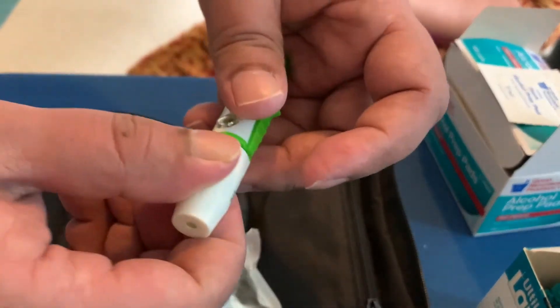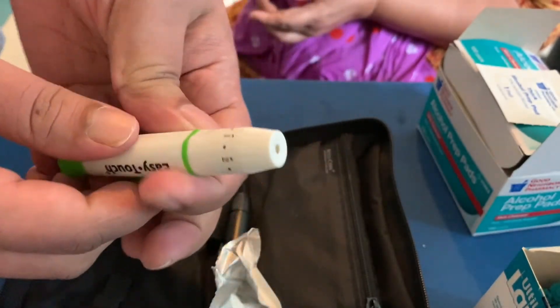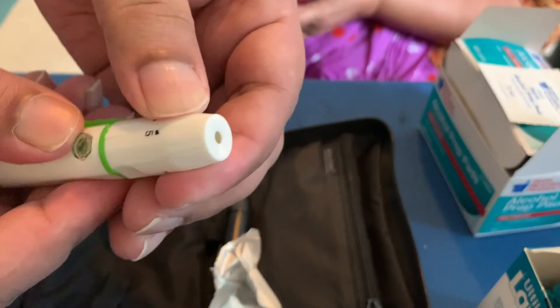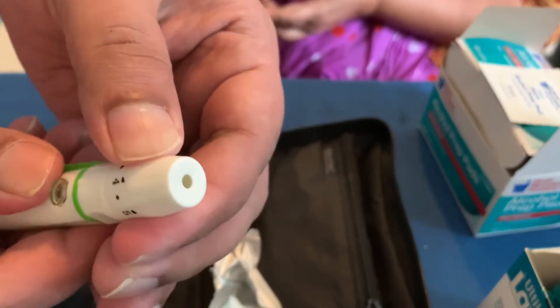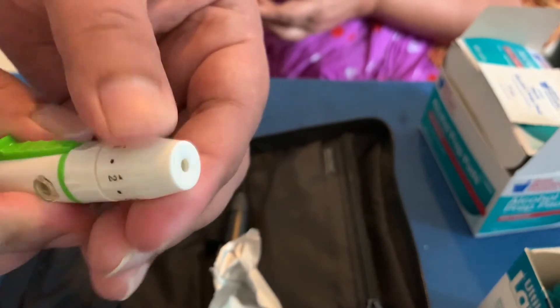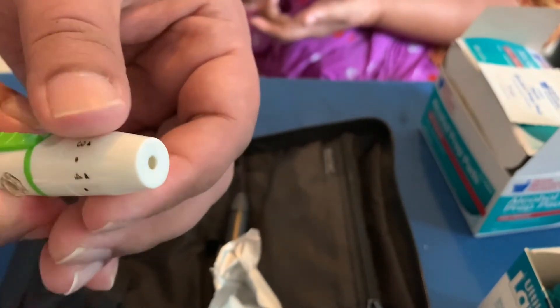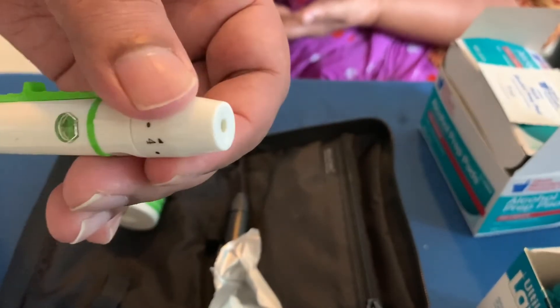Now we're going to close it, so your needle is ready to use. You want to use the needle to prick the side of the fingertip.